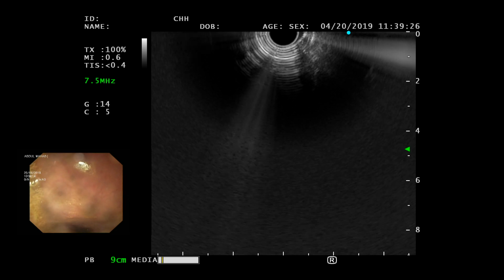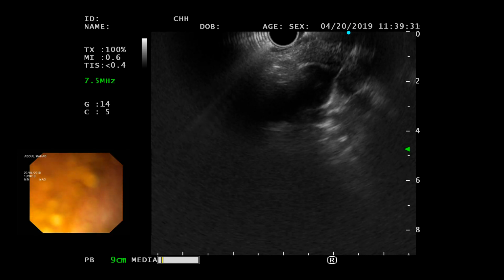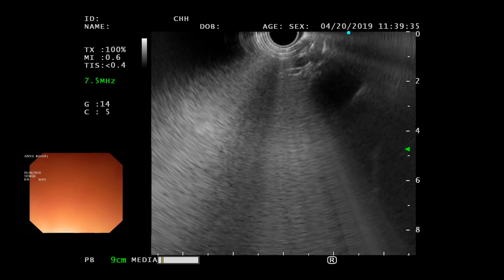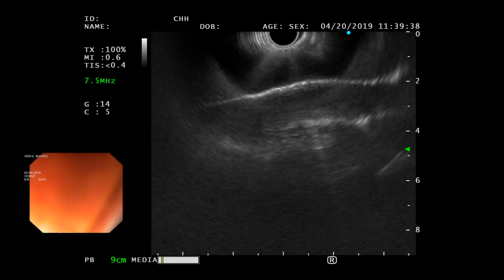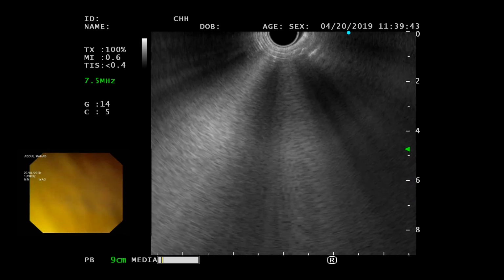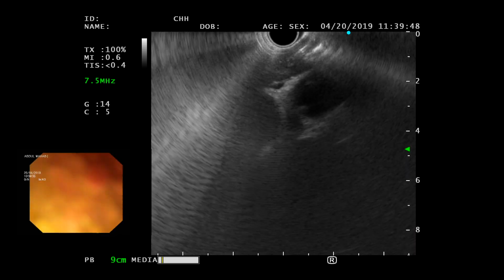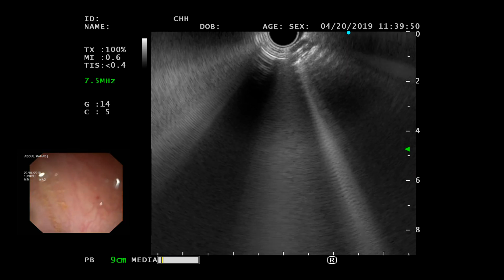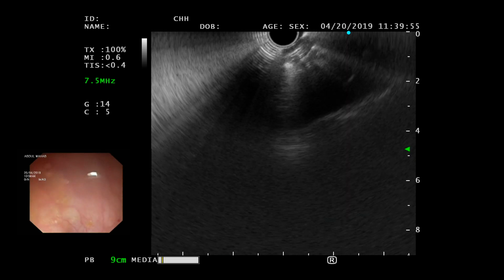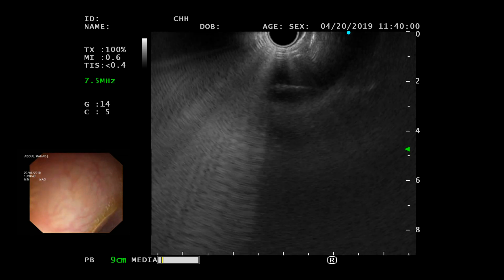Okay, so now what we're going to do is show you the AP window. So, what was the clinical context here? Okay, Mustafa, I wasn't expecting lymph nodes here in the mediastinum. The guy has chronic pancreatitis, so he's malnourished, and he's got quite severe abdominal pain because of his chronic calcific pancreatitis. So this is just an incidental finding that we got. So now he's going to hopefully do the AP window by himself as well.